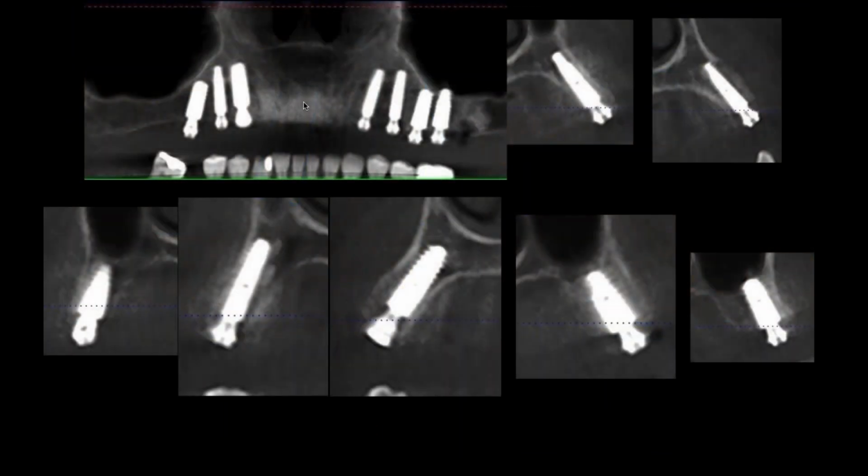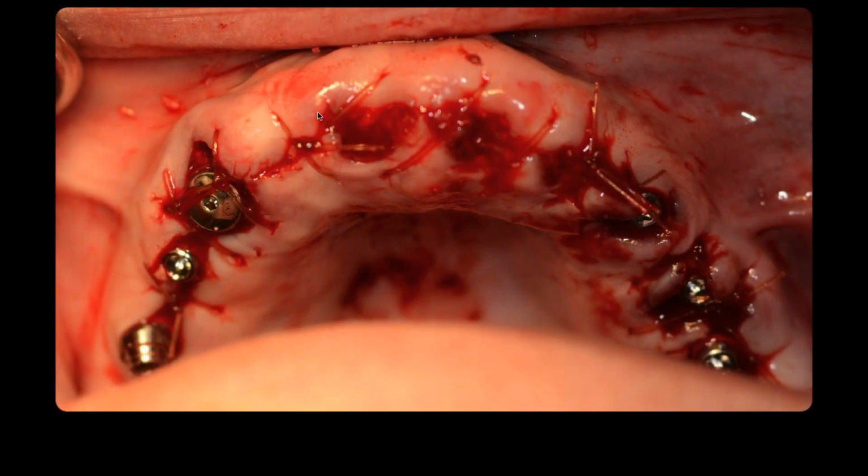So I put the patient tracking array in the front, and then I did this side, and then I took it out and reversed it, did this side. So everything was navigated, and then I put the implants in. Now once the implants are in, navigated, then I treat these like single tooth sites.